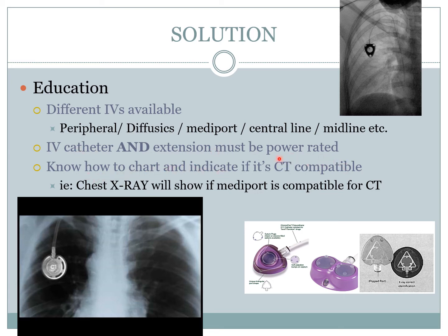So if it's not power rated, meaning if there's no indication of the PSI, if there's no indication or charting of any rates to the scans, then we are not allowed to use it. By no means, not allowed. Because if you use a power injector, that is just going to go at a high rate. And we need to know that it's not going to cause any harm to the patient.